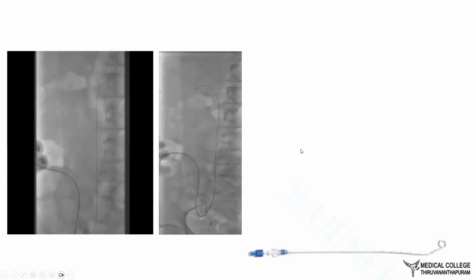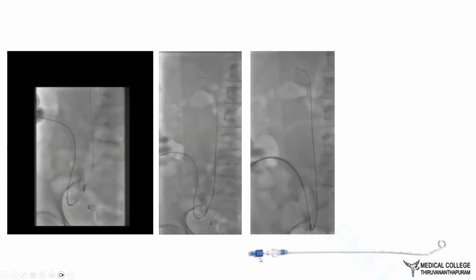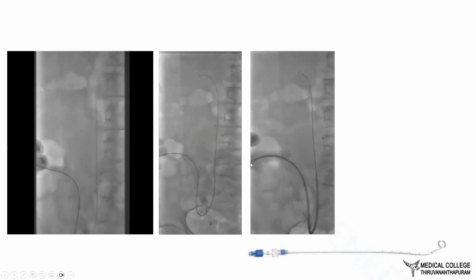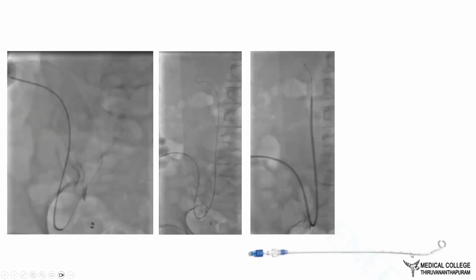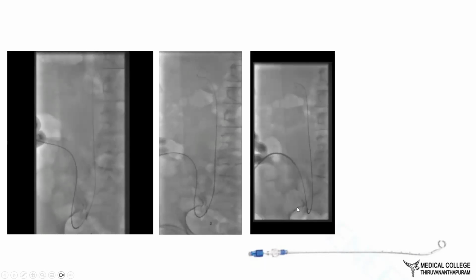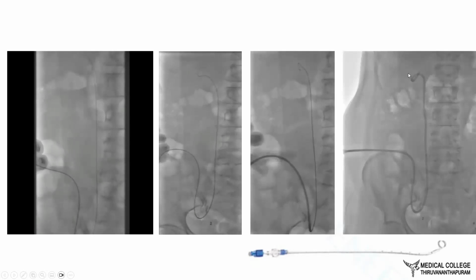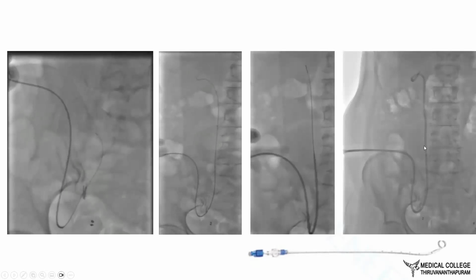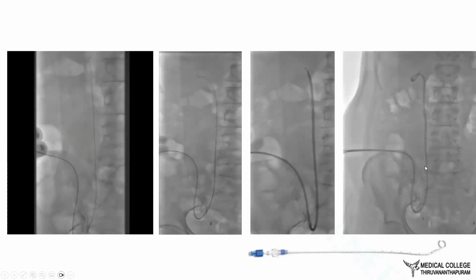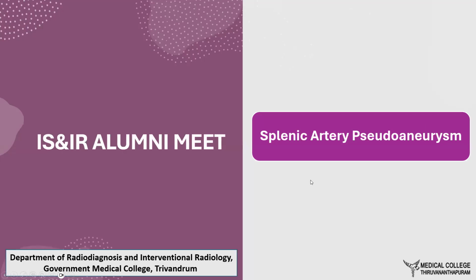And then, because keeping it dry was one issue, and second, this part of the catheter had to come out through the stoma, we used a 45 centimeter PTBD internal external catheter. It had multiple holes all throughout. This is about 45 centimeter. So the tip would come out and the holes would be all throughout the pelvis till the upper part of the ureter. And you have a marker here. So the defect was somewhere here. So this is for a ureteral urine diversion.